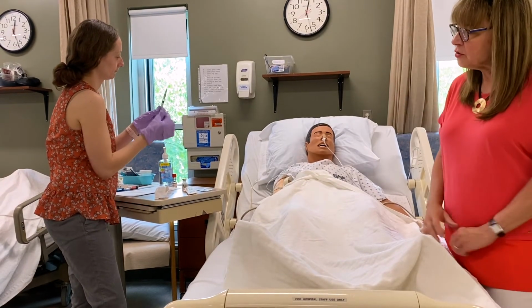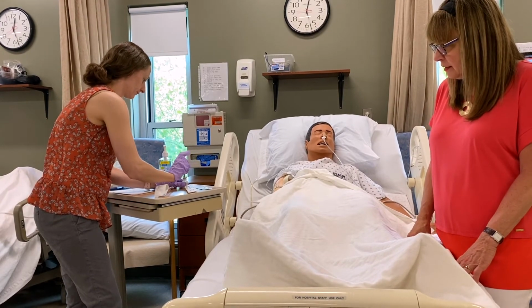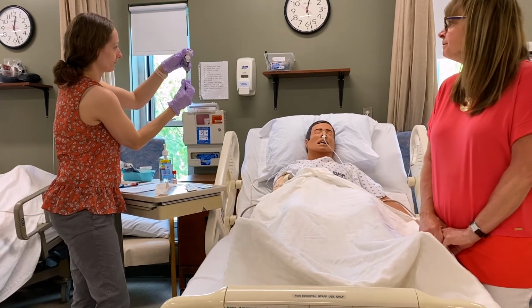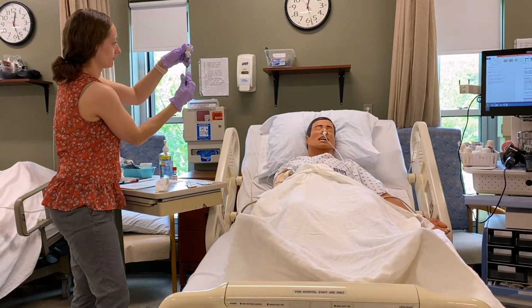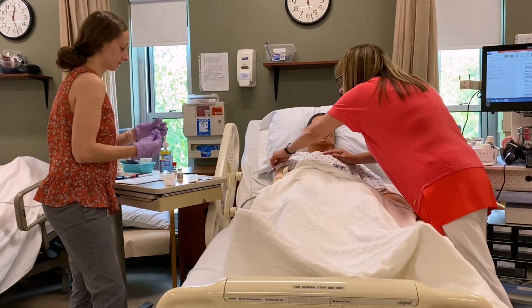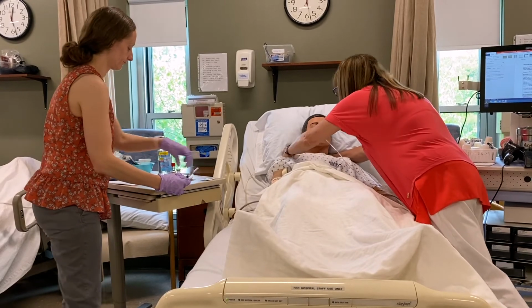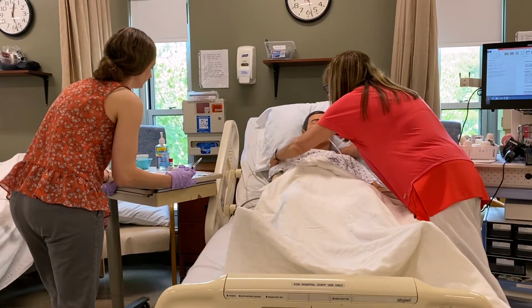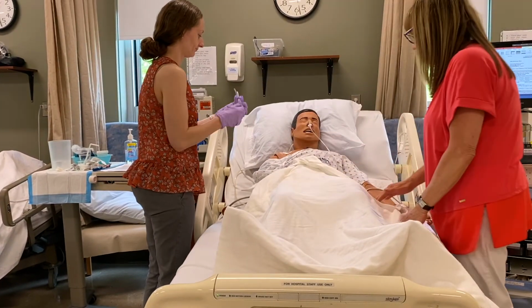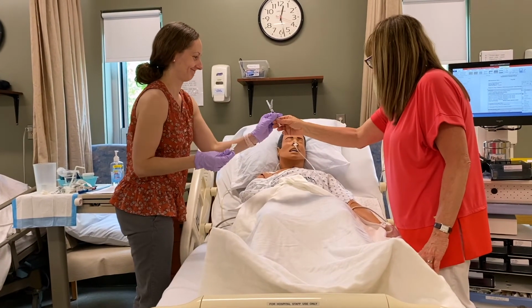She's drawing back 0.5 ml of air. She's going to put it through the bullseye in the vial. Okay, and then it's going to draw back her 0.5 ml. She's scooping the cap on correctly. Just get your deltoid ready for you. And we always verify with our faculty. Yes, 0.5.